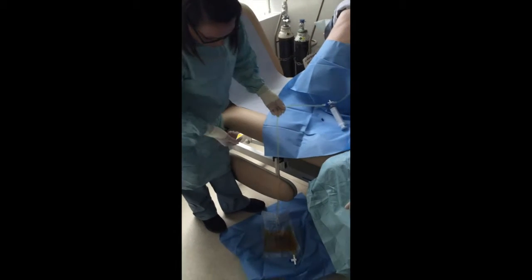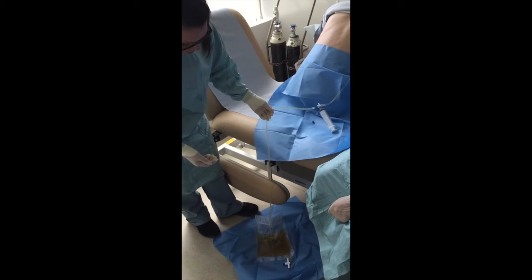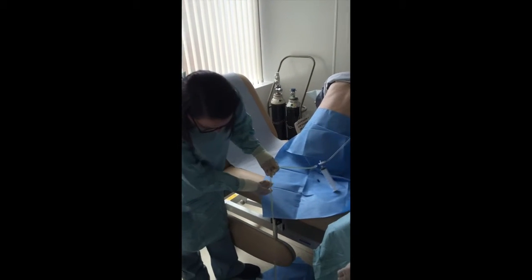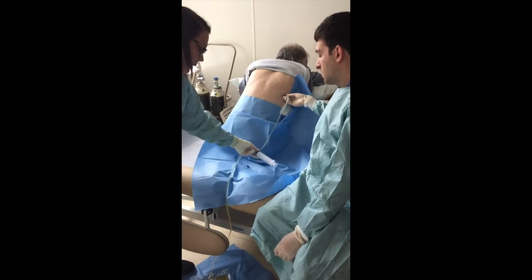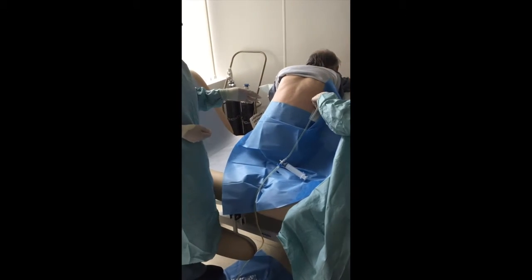We'd always do a chest x-ray if you drain a large volume of fluid. So if you do about 50 mils as a diagnostic tap and there's no complications, you don't need to do a chest x-ray. But for a therapeutic aspiration, we would always do a chest x-ray. Okay. So if you're doing a diagnostic, how much would you take? So 50 or 60 mils, so you can probably get about 60 mils in a pleural syringe. So you wouldn't need this equipment, you'd just literally take a syringe.